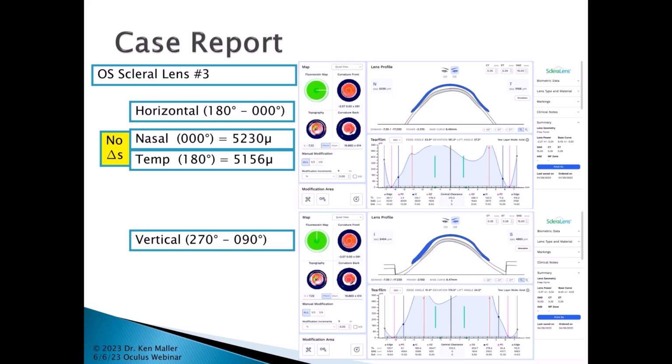When I get the data off the CSP Pro and I consistently get out to 18 millimeters, that gives me very, very good confidence that all the data inside there is incredibly reliable. And I am not working hard to get out there. Due to the way that camera is mounted on there, it really is fairly easy to get out to 18 millimeters of coverage. The only time you start getting into very dicey situations is when the cornea and/or sclera is very scarred up and things start getting a little tougher, just as with the scan in general. But it's certainly not hard to get out to the 18 millimeters.